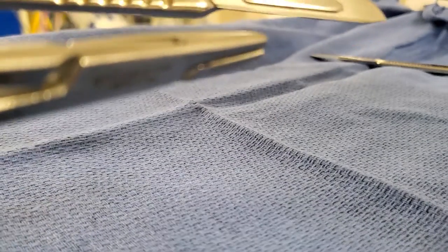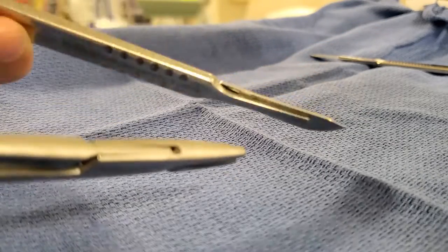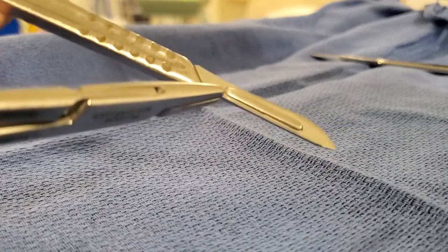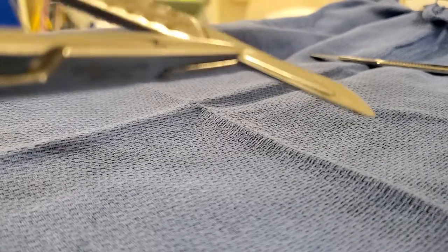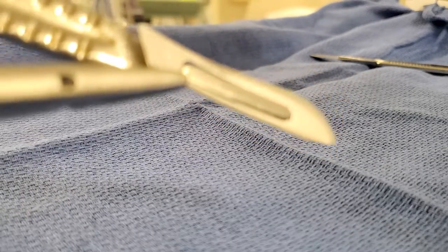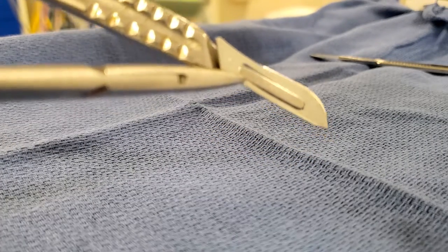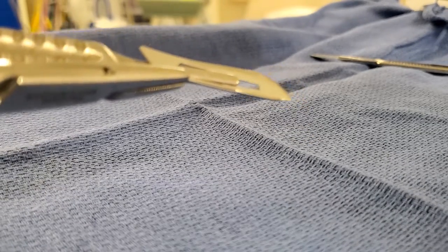You're going to grab it from the bottom here. I'm grabbing it and just lifting it a bit — you can see that I'm lifting it a bit — and just pull out.